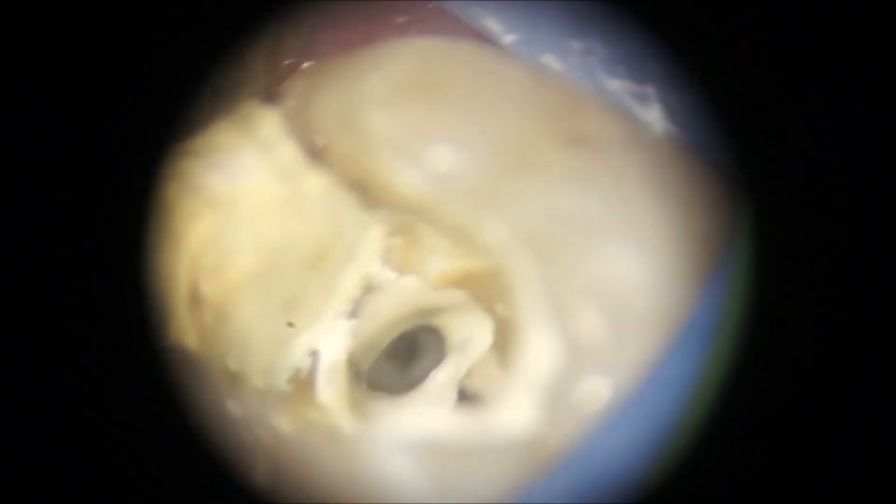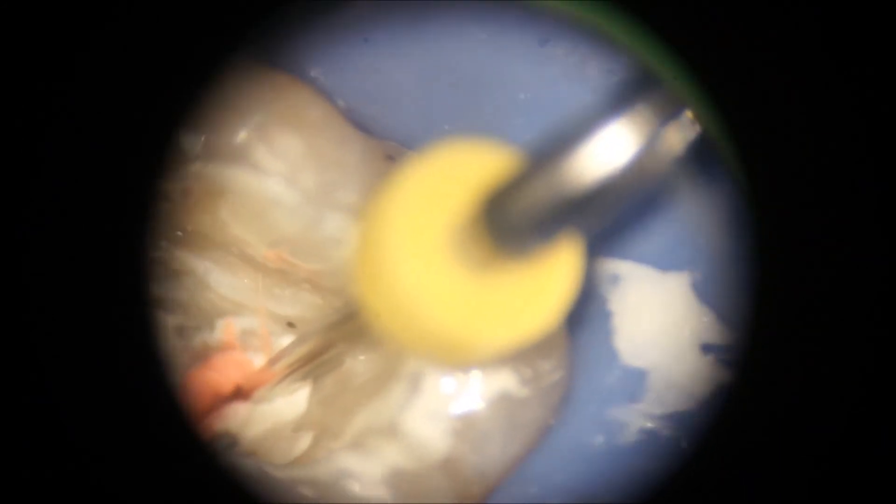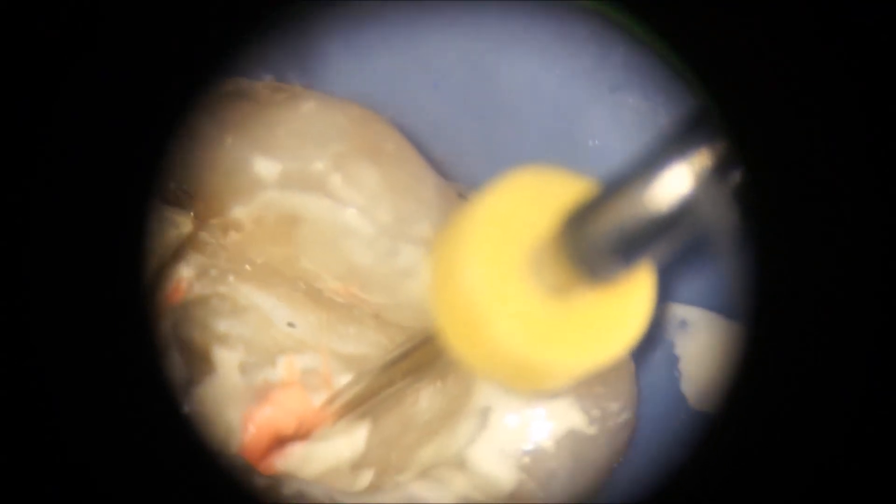As you can see in this mesial canal, the fluid draining is indicating communication between the canals. I'm also a firm believer in a warm gutta-percha technique — in this case it was the continuous wave vertical compaction into the apex, and the backfill was done with pre-heated gutta-percha. For curved canals I will use a carrier-based obturation.